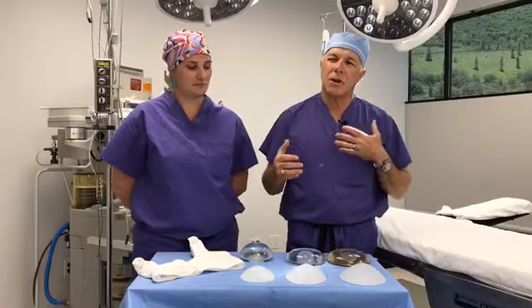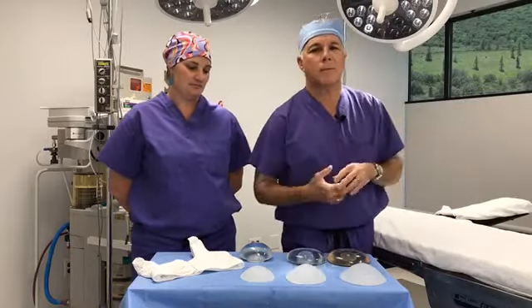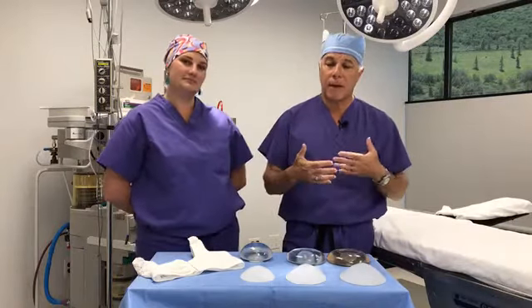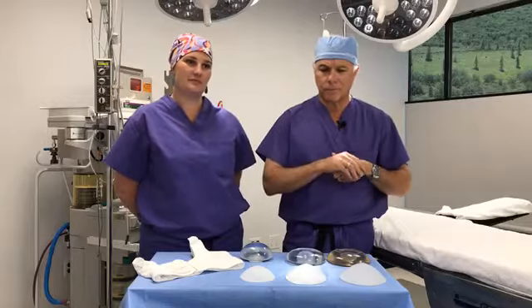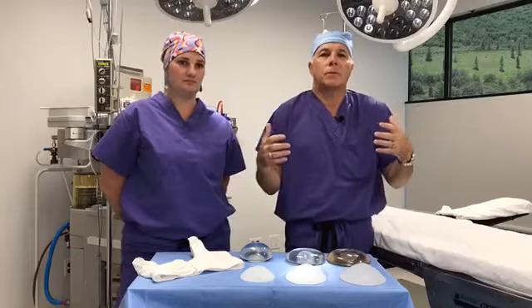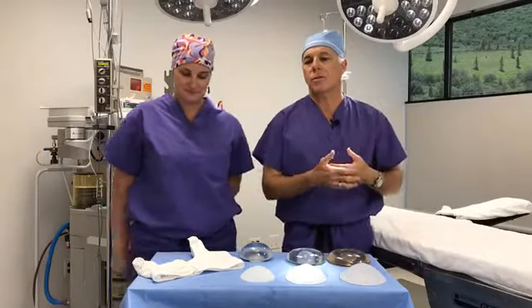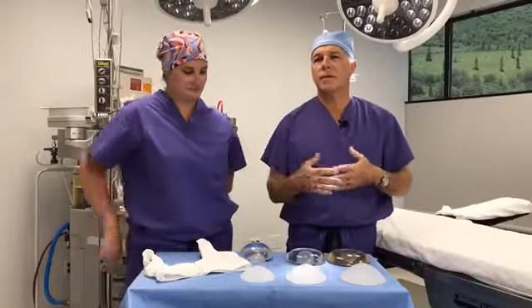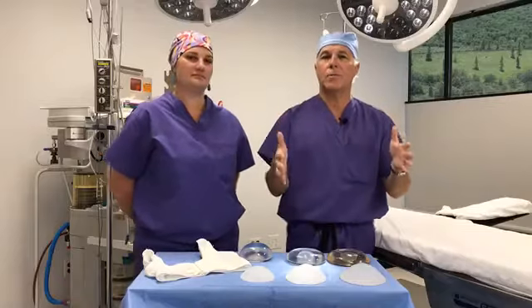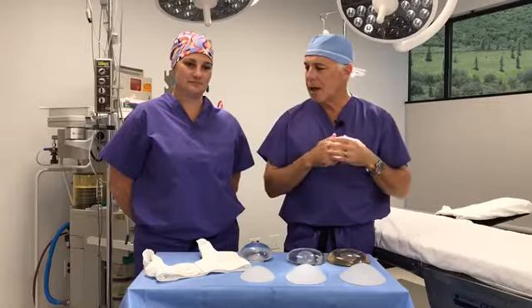There's always a lot of talk, usually buzzing around the internet, that everybody thinks when they wake up they should have been bigger. I don't think that's our experience, because if Lindsay identifies for you, trying on sizers, what's too big, what was uncomfortable in terms of your appearance, we can just put in something just less than that. Then we know that we put in the largest implant that the patient's comfortable with, that's in the range that we designate, that we think will give a real natural result.